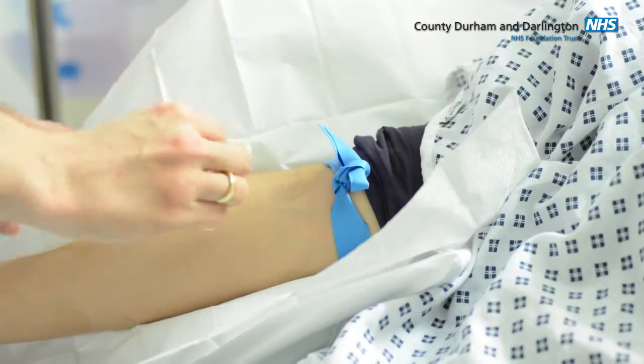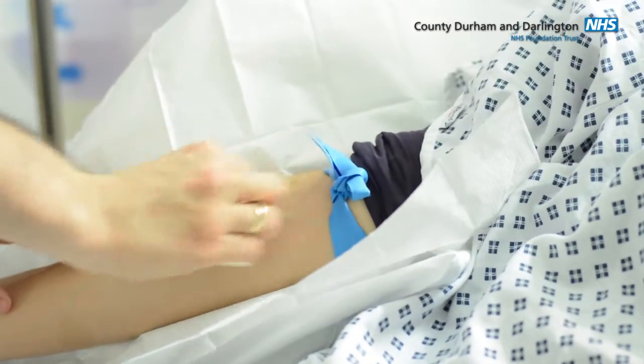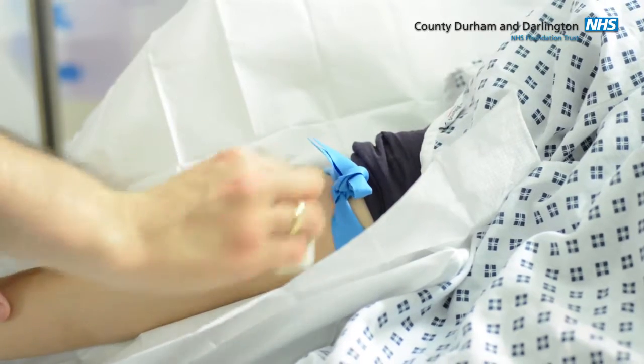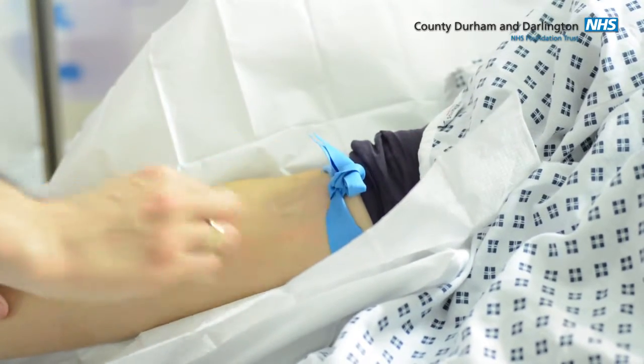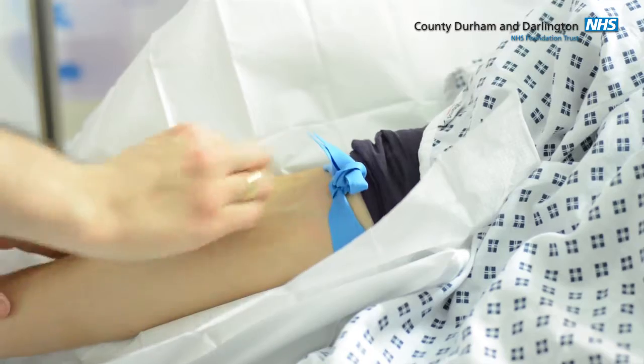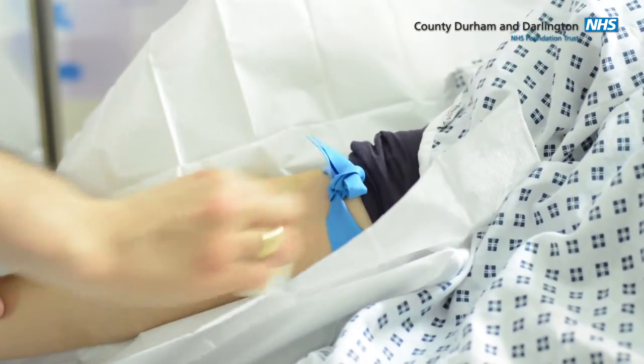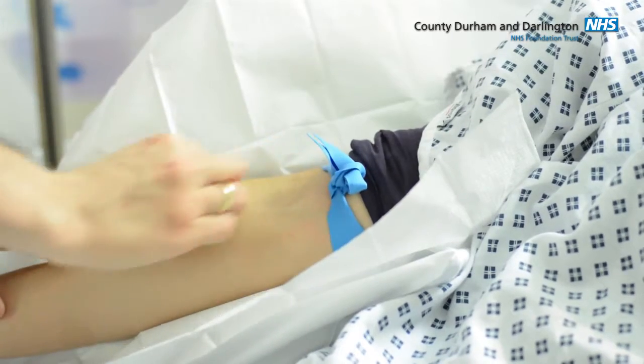Excellent. So I'm just going to give it a clean. Just time it for 30 seconds, okay? Clean the patient's skin of the proposed collection site with Chloroflex for 30 seconds and allow to air dry. Please at this point do not repalpate unless you're wearing your sterile gloves.